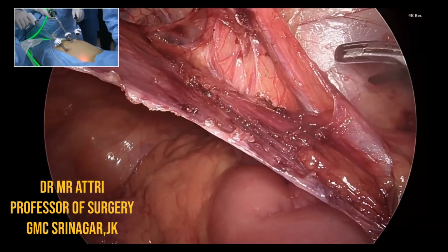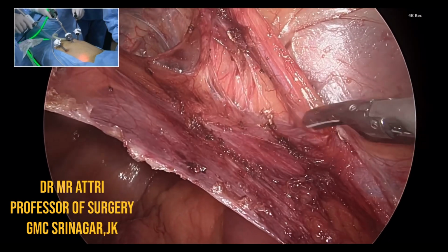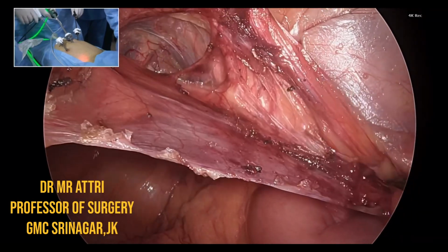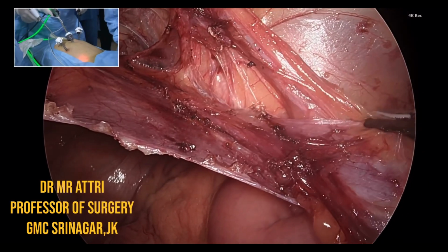Can anybody show the CT scan? Dr. Sumit, we have chosen this case especially for you so that we give you some trouble and you will show us all the expertise that you have.